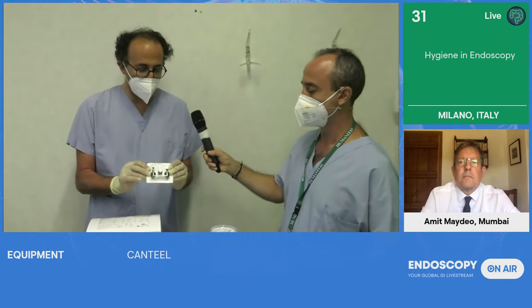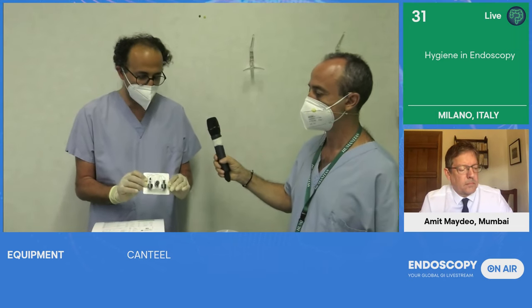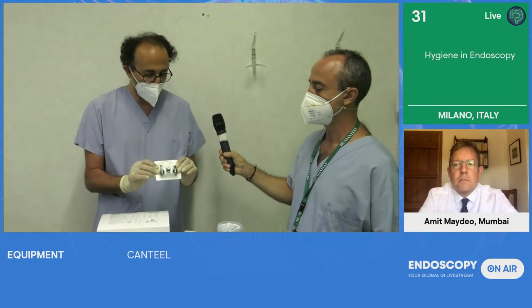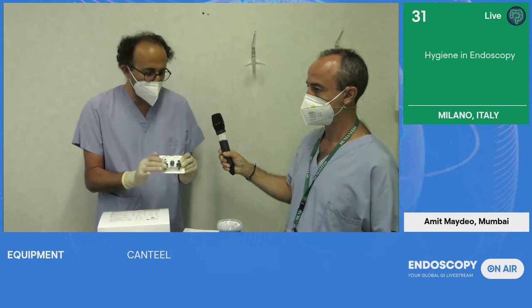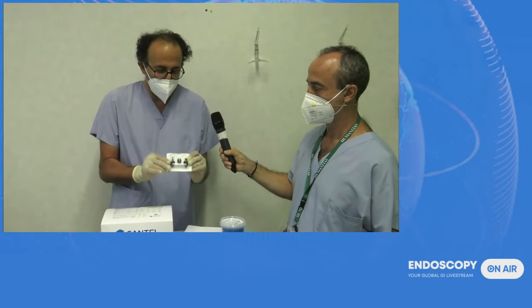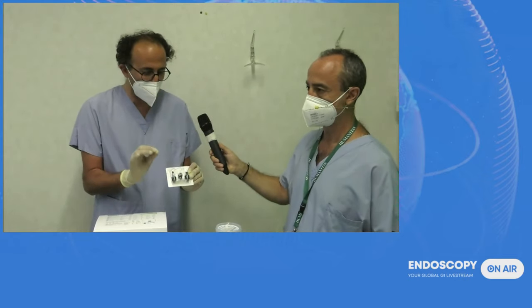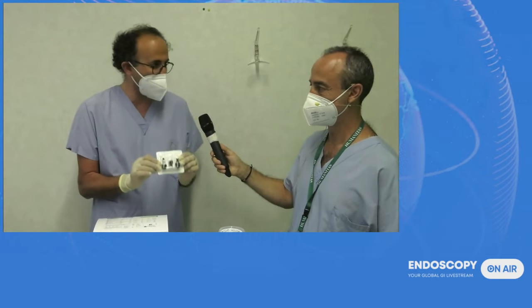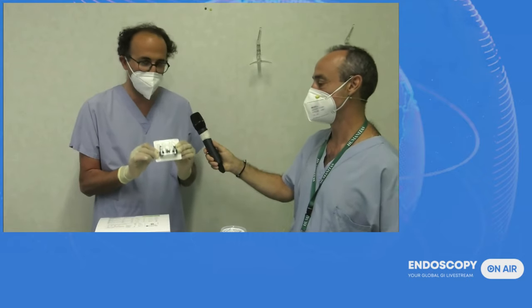So this was a quasi-randomized prospective study promoted by the two most outstanding Italian scientific societies in this field, comparing the contamination rate of a reusable valve with a single-use one, because you cannot exclude that this may also be contaminated. What was the result? That the reusable had a 30% contamination rate, while this had 0%. So this is a big difference. Yeah, so it's 30 to 0.